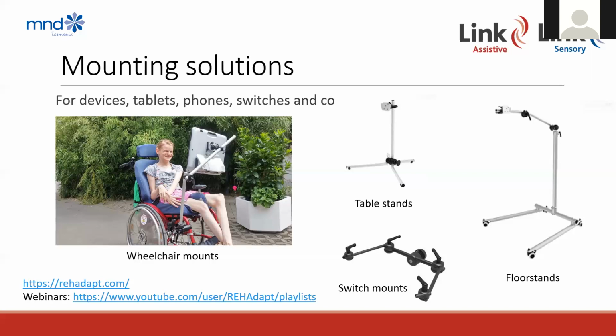And we might need different mounting solutions for different environments. Generally, people will have a couple of different mounting options for the different places in which they're wanting to use their assistive technology. So again, we'll go into more detail about what some of the options are as we move through this presentation.